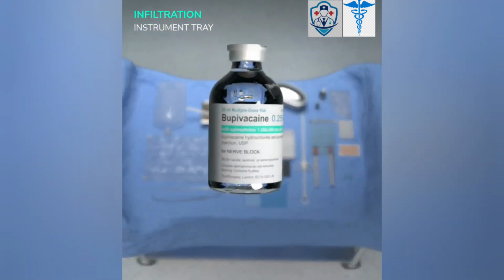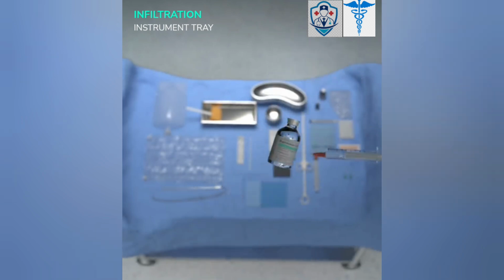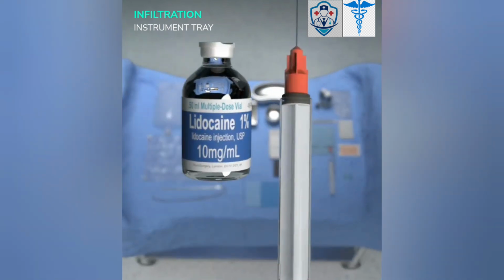Bupivacaine 0.25% with adrenaline 1:200,000 is a local anesthetic and should be aspirated into the 20 milliliter syringe with the filter needle. This is used at the end of the surgery to create a transversus abdominis plane block. Lidocaine is a local anesthetic and should be aspirated into the syringe with the filter needle. This is used for infiltration at the trocar sites during skin closure.